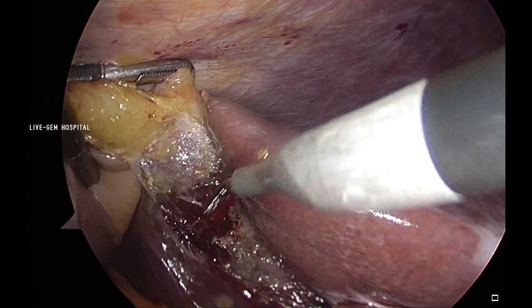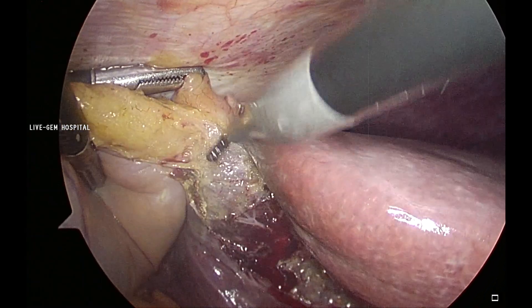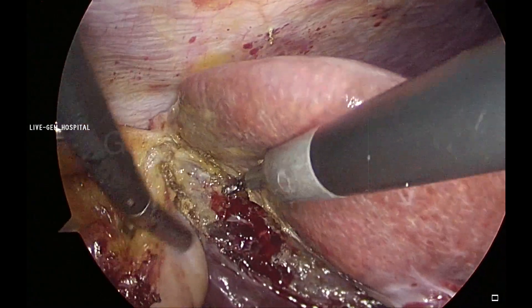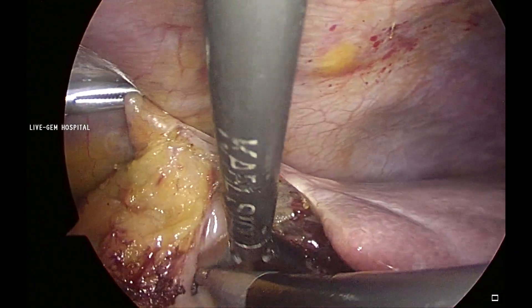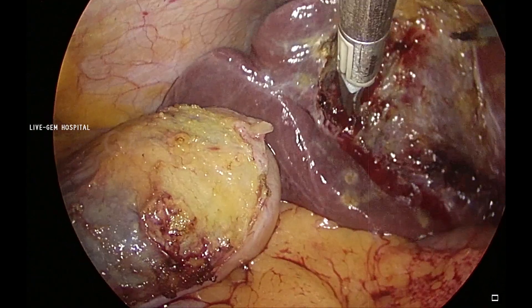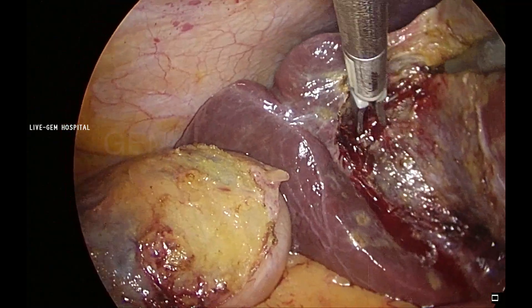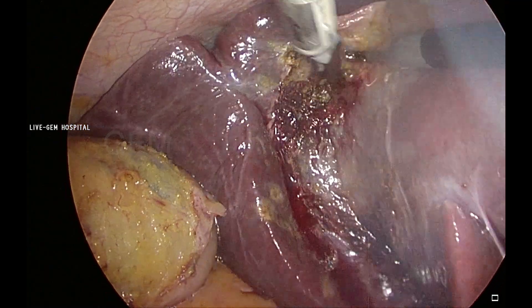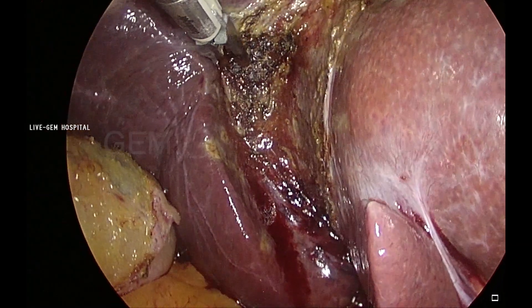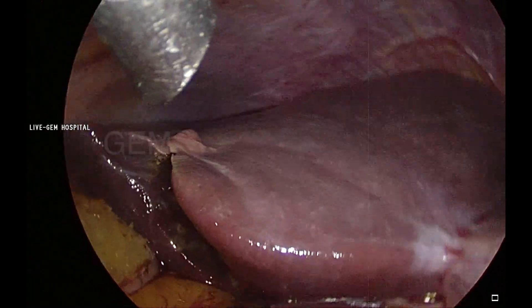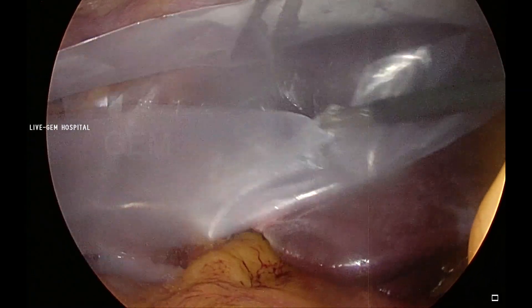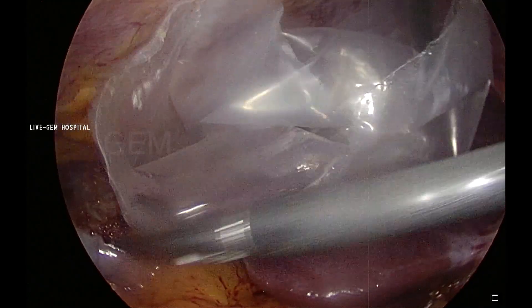Sometimes if you go too deep, a vein in the liver bed will bleed and you cannot apply a clip — you have to suture. I have a video on that — liver bed vein bleeding with suture in difficult cholecystectomy cases, which I will upload later. Now this is a very superficial one, so I am applying bipolar coagulation coming from the right subcostal port — my left hand — parallel to the liver bed so that effective coagulation will be there. So I am placing the gallbladder in the endo bag — it is a self-made bag.